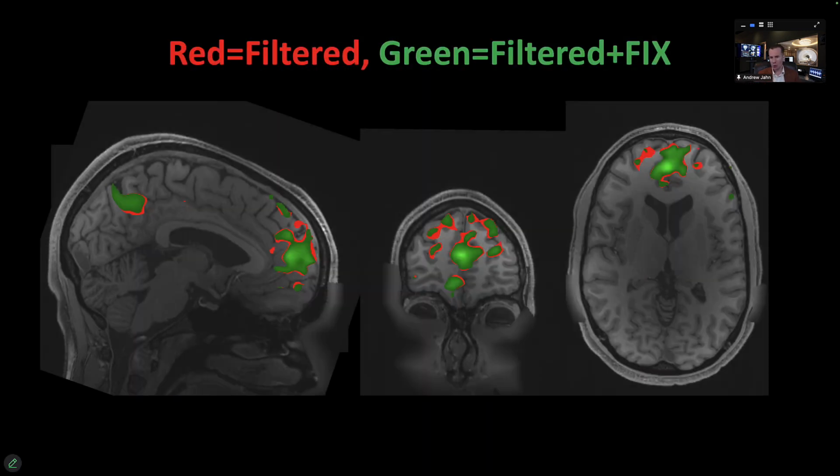Now, just in my own analyses, looking at data from the Human Connectome project, I looked at analyzing this through a typical FSL pipeline and then also using Fix as well, using a machine classifier that has been trained on the Human Connectome project. And here's just, within a random subsample, what the results might look like.